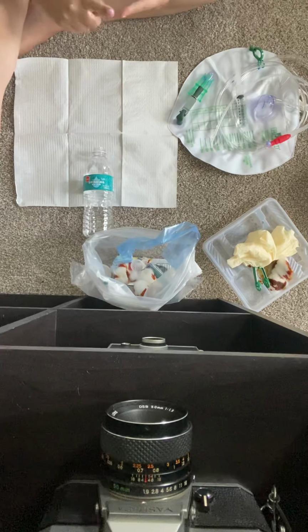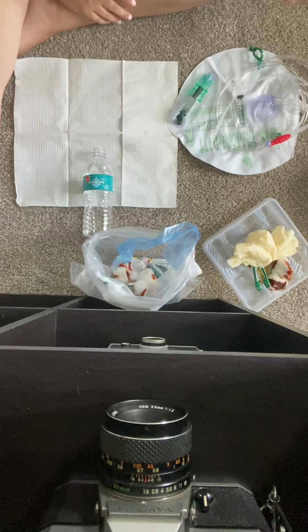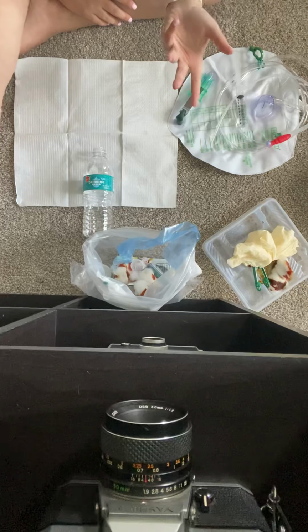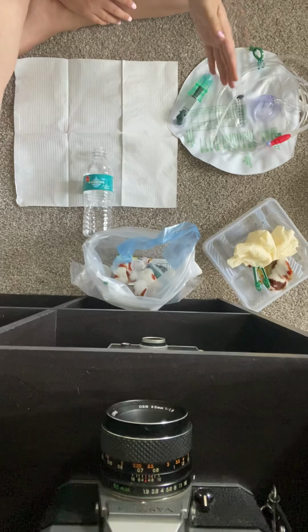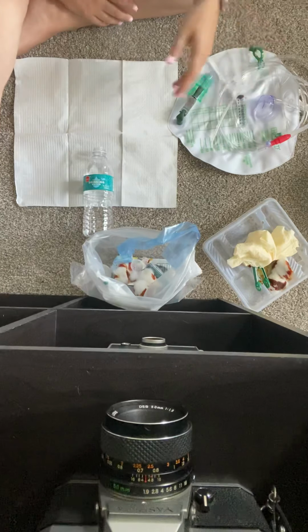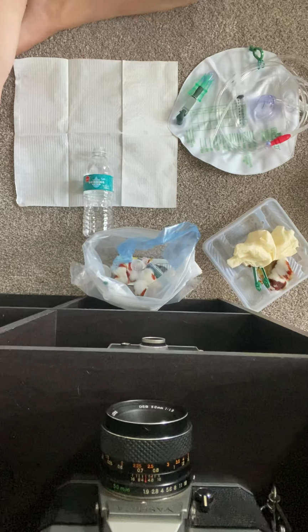And also I like to know what French. I can't tell you how many times I've grabbed a 16 French catheter and I forgot what French it was. So I like to have that right there, and I'm already in the room, and if I throw it in the trash, it's usually within eyesight, so I could just be like, oh yeah. Like this one, I put in a 14 French.